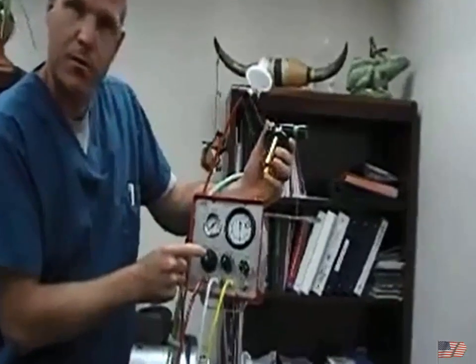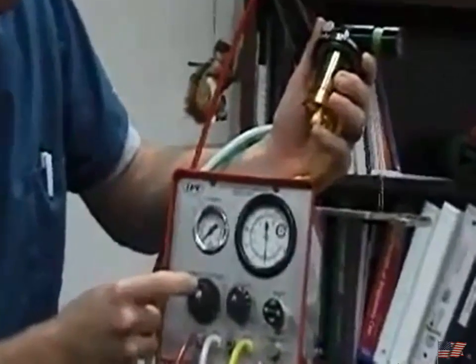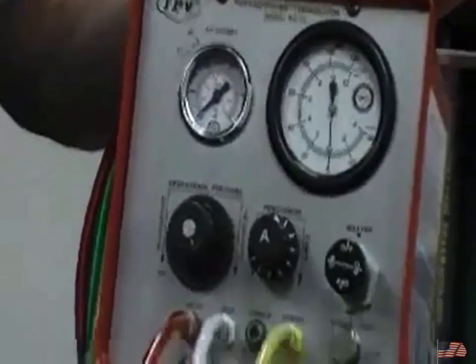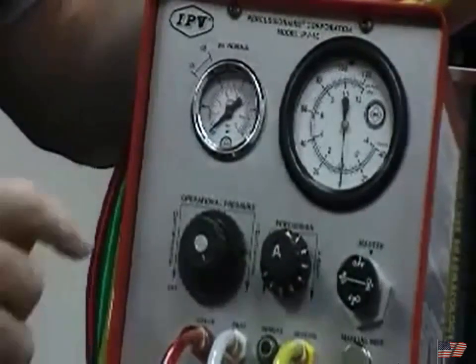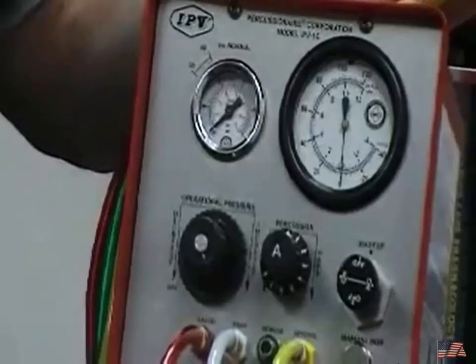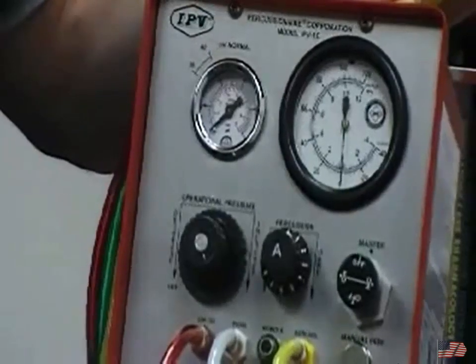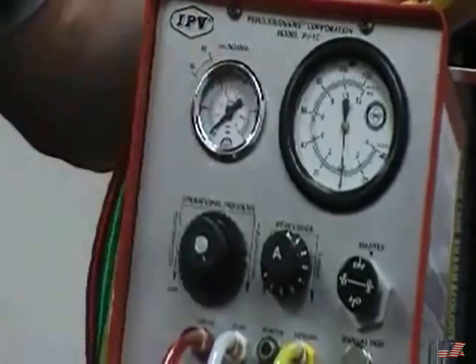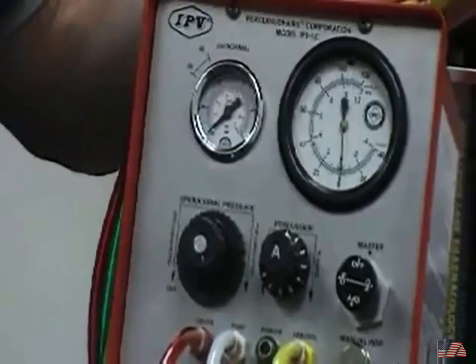As far as the machine is concerned, here's our operational pressure, or our drive pressure. This is considered your mean airway pressure. What I want to do is set that according to the compliance of the lung. So a more compliant lung, I'll set it lower, so in the 25 to 35 range. A stiffer set of lungs, I'm going to set that higher. We're going to need more pressure to move that chest around, so I would set it 35 to 45. This is again for an adult patient.